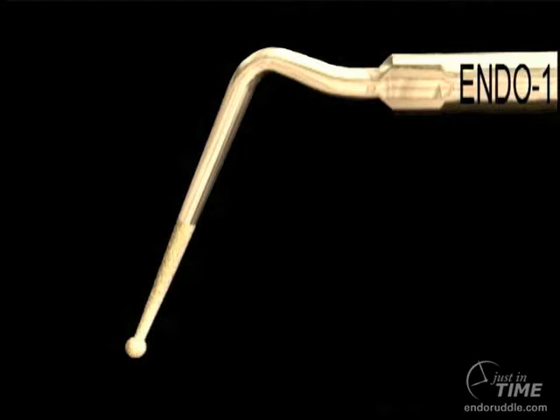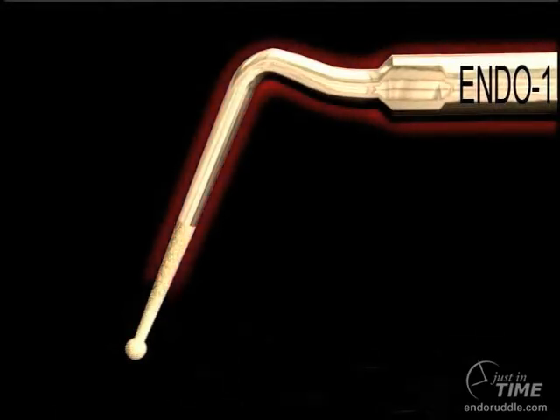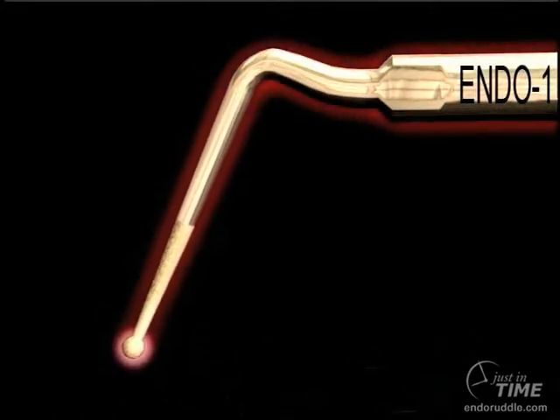In this instance, you're looking at a Pro-Ultra Endo One tip, and it's basically a tapered cylinder with a ball on the end. We work at higher energies, preferably with a P5 generator, and at these higher energies it's important to know that the tip is moving in a linear motion.